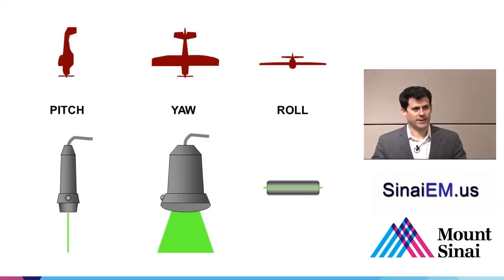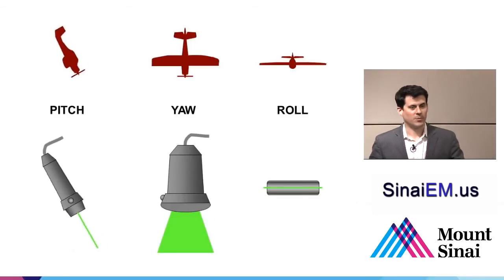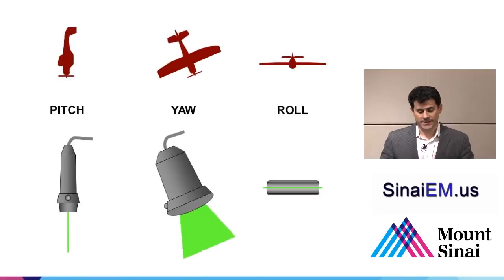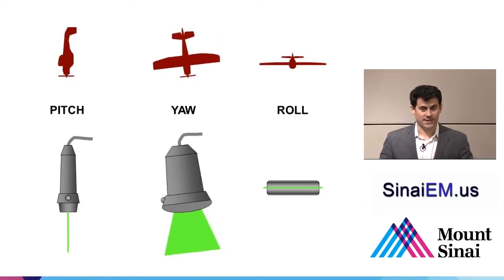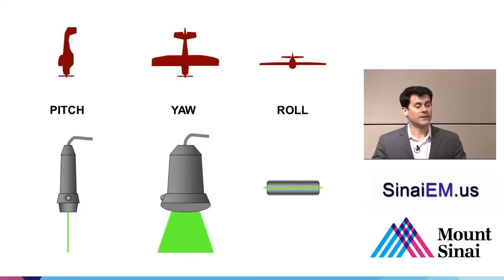So let's talk a little more lingo about the ultrasound probe, and I've borrowed here lingo that's often used in the armed services or the aerospace industry, just to talk about the 3 different degrees of freedom or the different ways you can orient the probe in space. So you can turn the probe and sort of fan it up and down, and if you were in an airplane, you would call that the pitch of the plane going up and down. You can fan the probe side to side or slide the probe side to side, and if you were in an airplane again, you would call that yaw, that side to side motion. And finally, you can spin the ultrasound transducer right on its axis. If you do that in an airplane, it's called a roll.